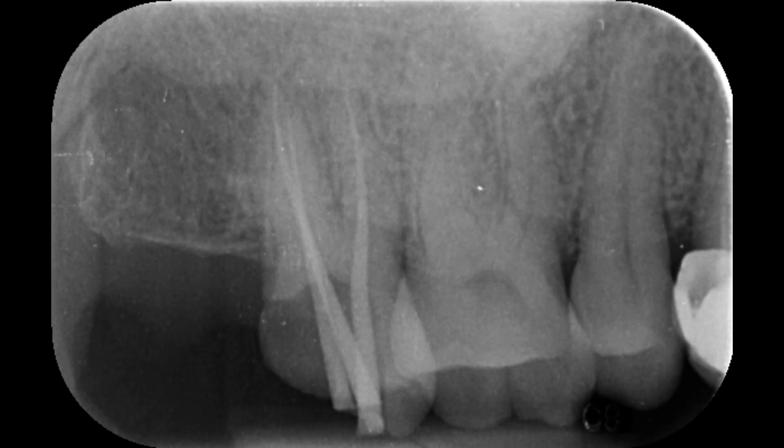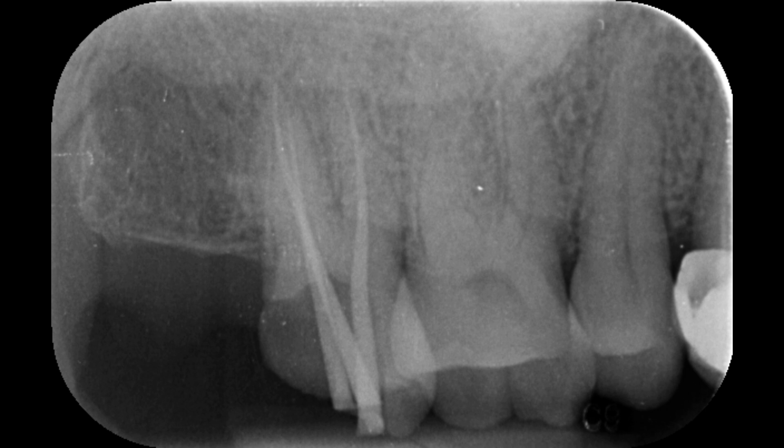After that I took the cone fitting radiograph. This is the cone fitting radiograph where you can see the three cones to the full working length.